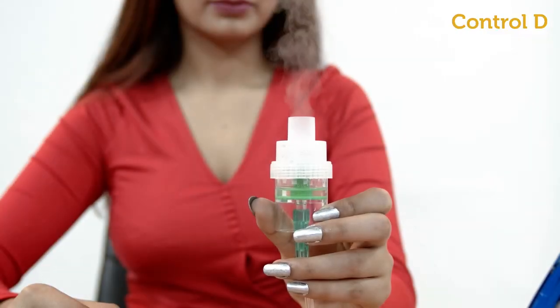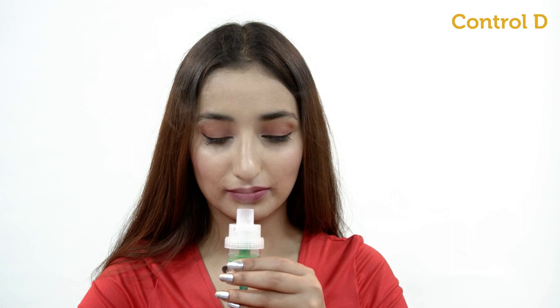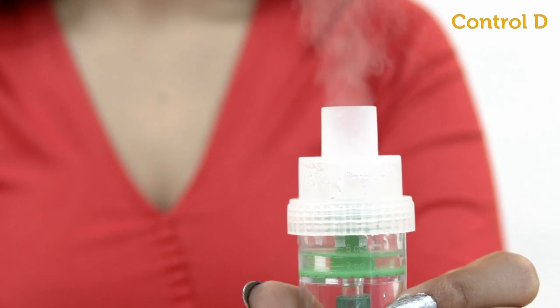Press the power switch and the nebulization will start. Observe whether the aerosol is generated, converting the medicine to mist. Hold the medicine chamber in upright position.